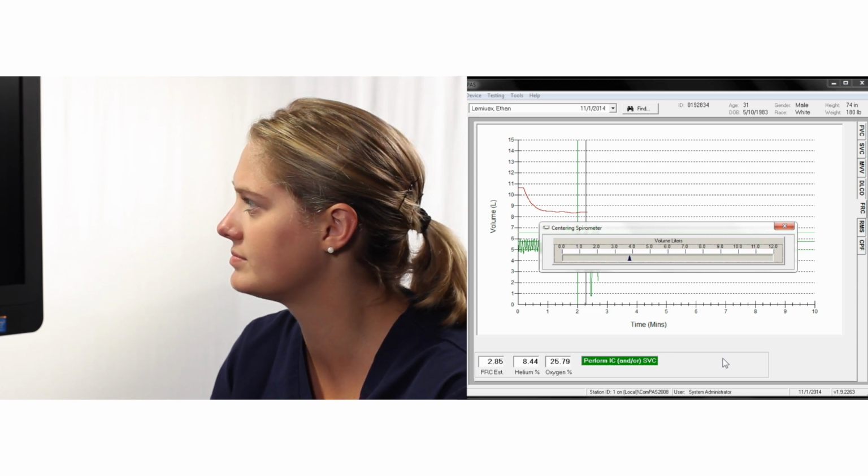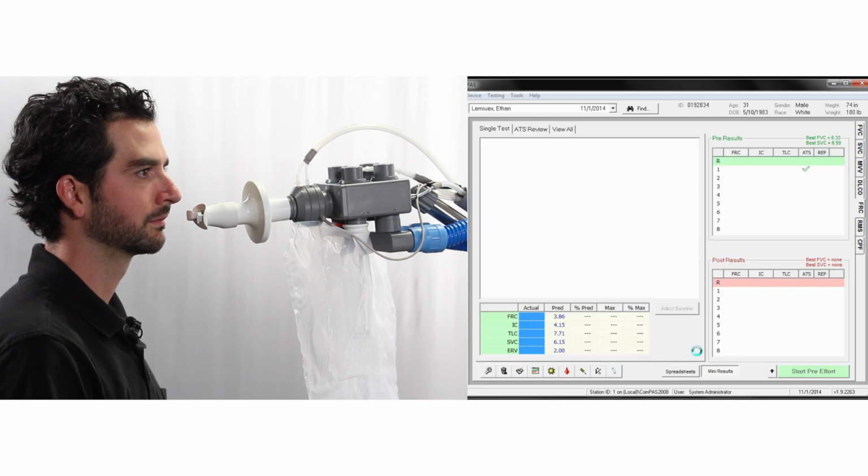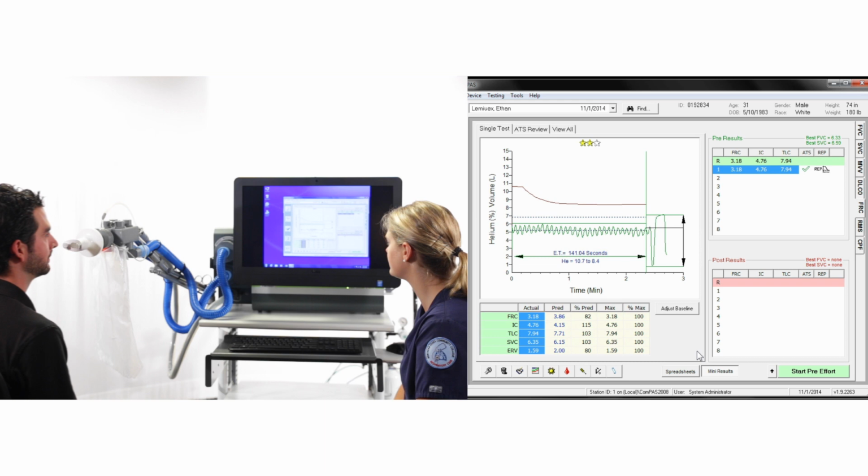If you want to repeat the test, the subject should be given at least 5 minutes to return to normal lung conditions. On the mini results screen, right-click functions allow the manual selection of data if the technician wishes to change the results going to the report.